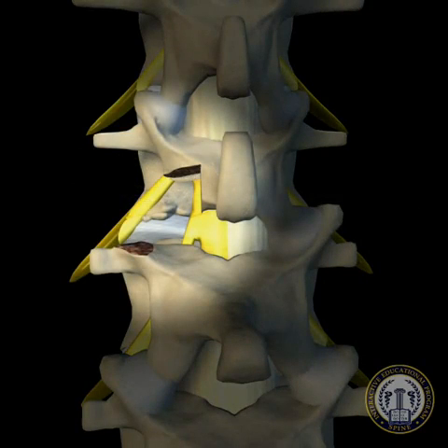Though it is unnecessary to expose the entire exiting nerve root, it is important to be aware of both the root's location underneath the superior pedicle and the amount of space between the medial edge of the exiting nerve root and the lateral margin of the traversing root.